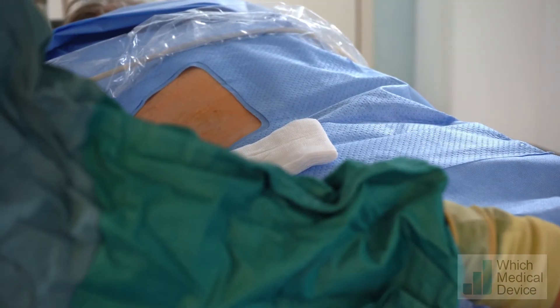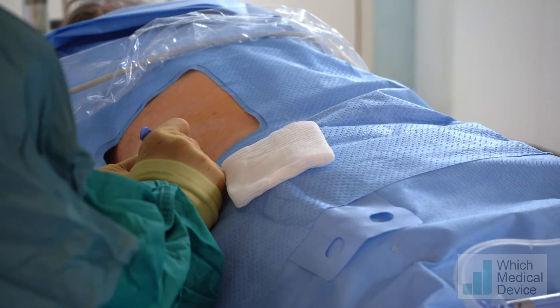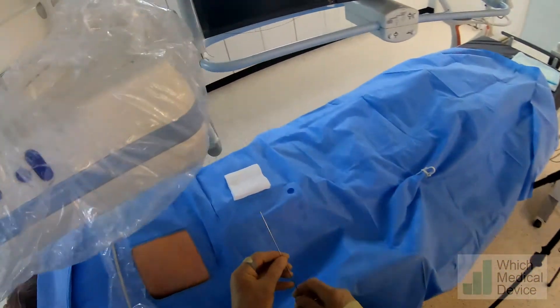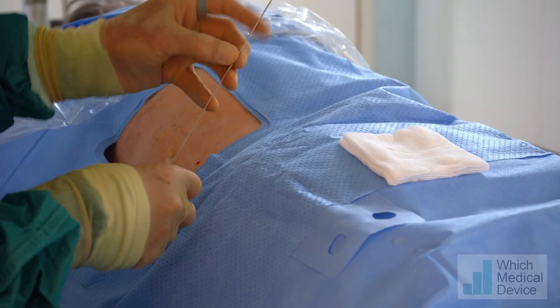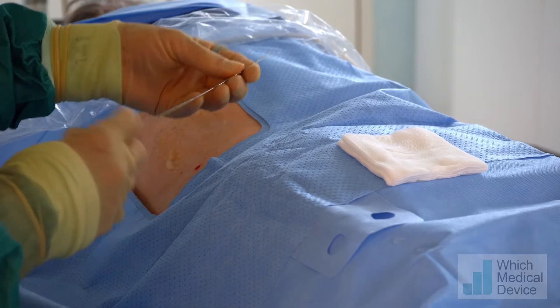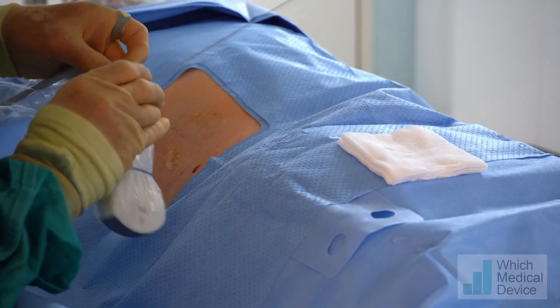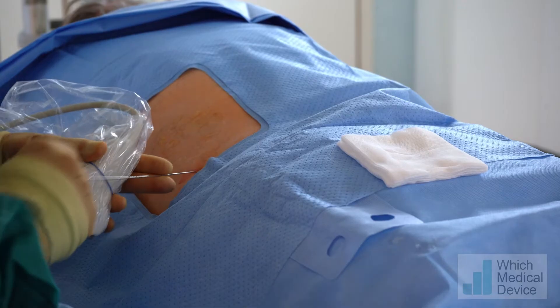We're just going to make a little nick on the skin. Now we're going to use this 18-gauge needle. It has a diamond-shaped tip — it's a non-cutting needle, relatively rigid, and it has an echo tip. Because it's 18-gauge and fairly rigid, it will go where I direct it, rather than a very fine needle which tends to bend all over the place.